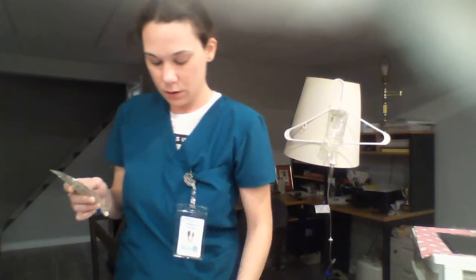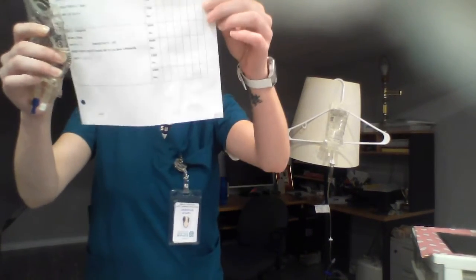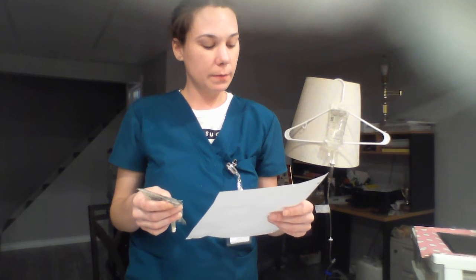I'm going to go right into my first check, comparing my med to my MAR. So this is for Sid Garland. Sid Garland, drug is ceftriaxone. Dose is 500 milligrams.